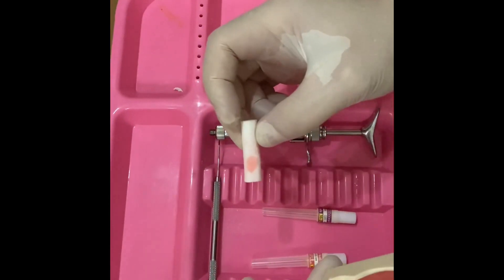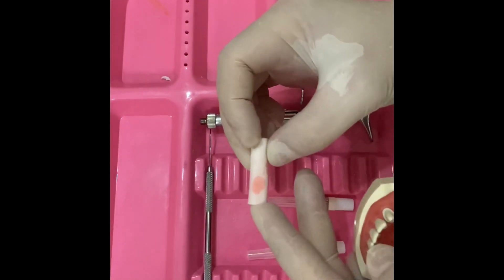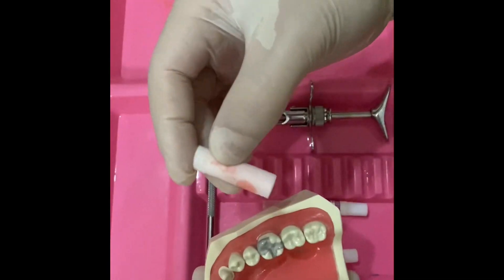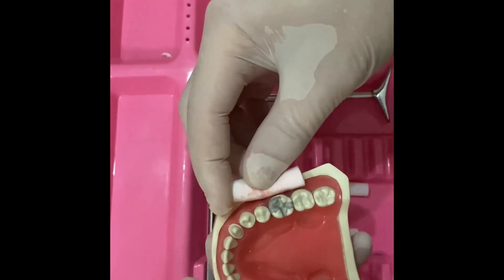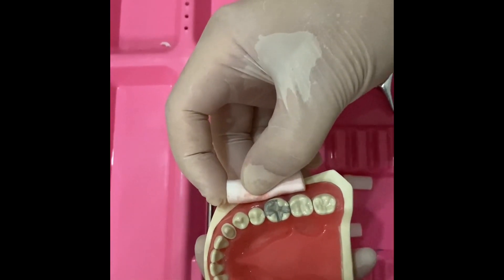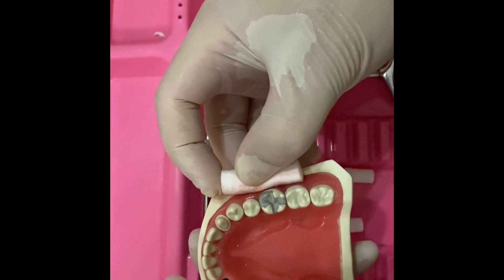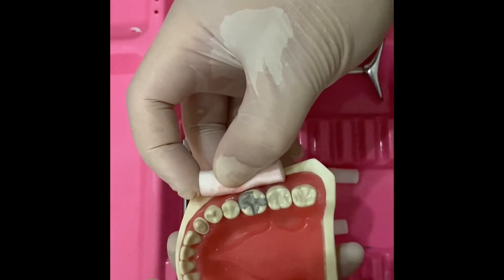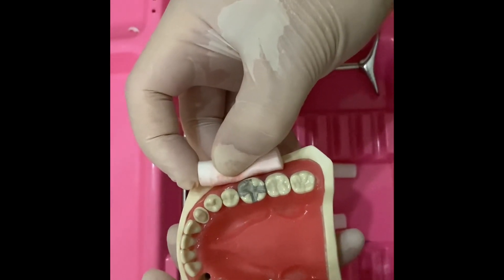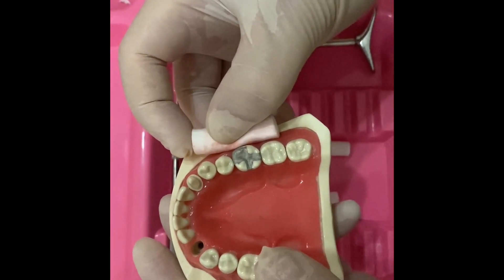For topical anesthesia, we apply a small amount of gel on a cotton roll and apply it for about two minutes in the area where we will provide the injection. Waiting two minutes provides about two millimeters thickness of anesthesia for the mucosa, which will reduce the pain of needle penetration.